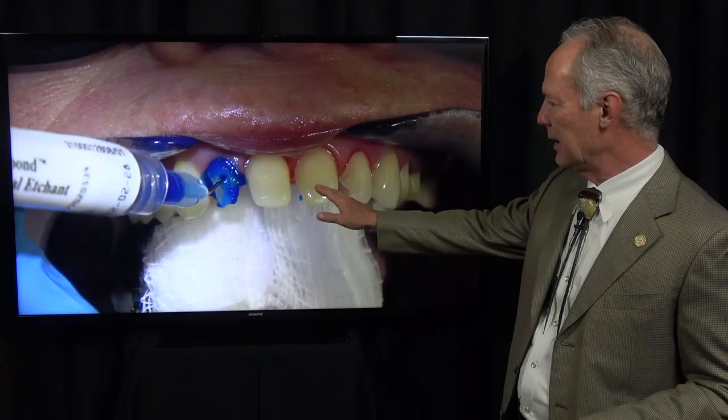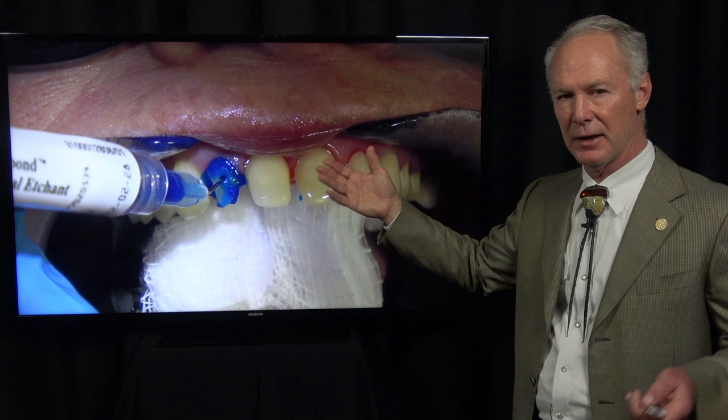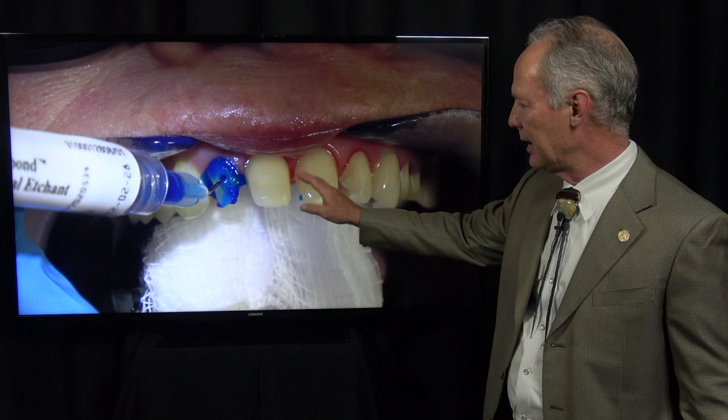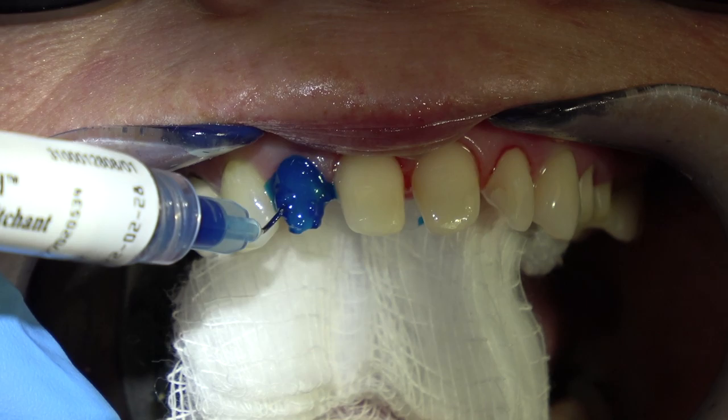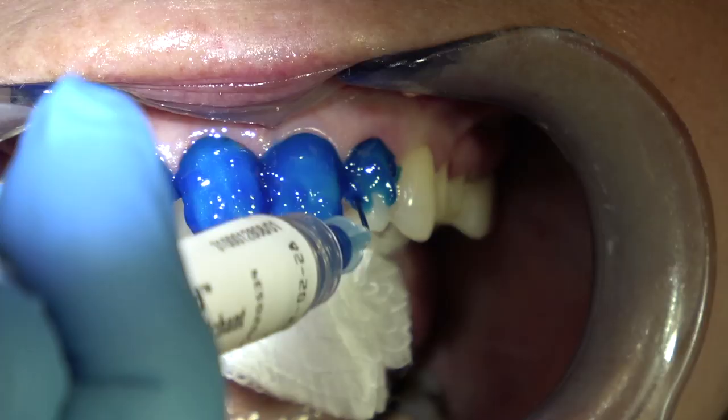So you can etch enamel 45 seconds to a minute. You only etch dentin 15 seconds. So what if you've got dentin and enamel? Etch the enamel for 30 to 45 seconds, then squirt it on the dentin for the last 15 seconds. And then rinse this off with ice cold water out of the water bottle.